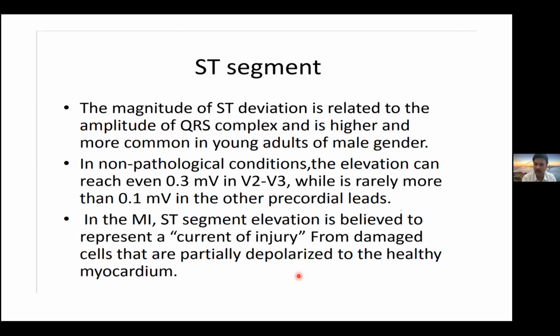All currents, as I told you, will always be positive when conducted towards the electrode, and negative when away from the electrode. This will make it simpler. When it is epicardial, the current is conducted from the endocardium to the epicardium. You are placing the lead on the chest, so it is toward the electrode. There will be ST elevation.